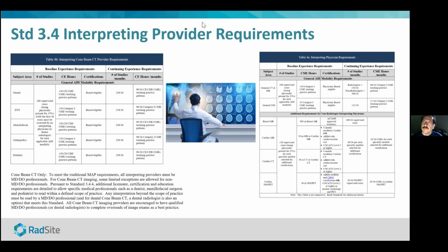And so thanks for underscoring that, Christine, as far as where to find those cases. I think most practitioners will find that they can hit the ground running with a new system by spending time in advance, finding somebody to help out as the supervising dental expert, and also finding cases either that they've done at their practice or at someone else's practice.